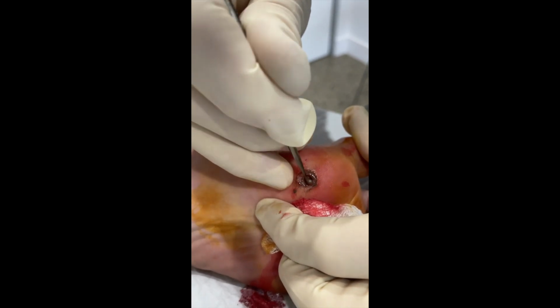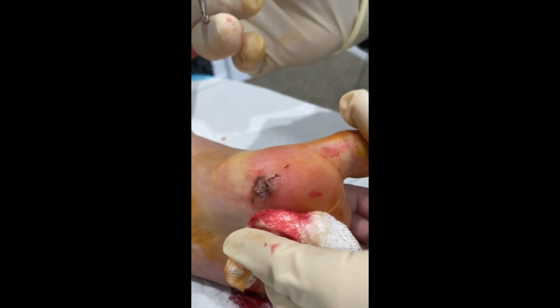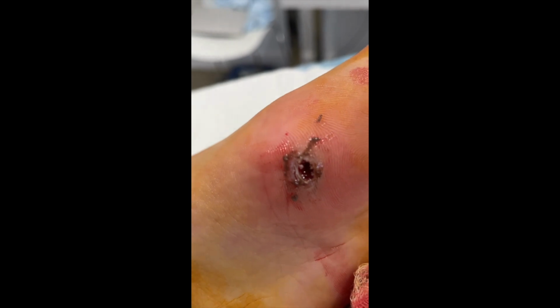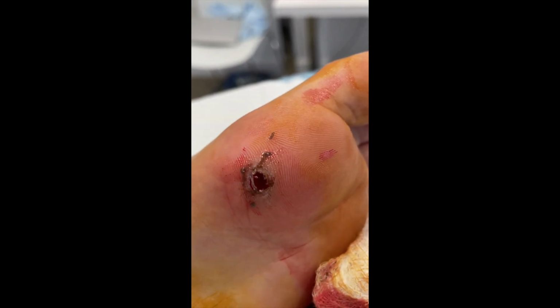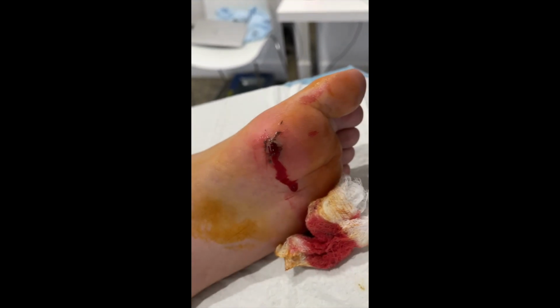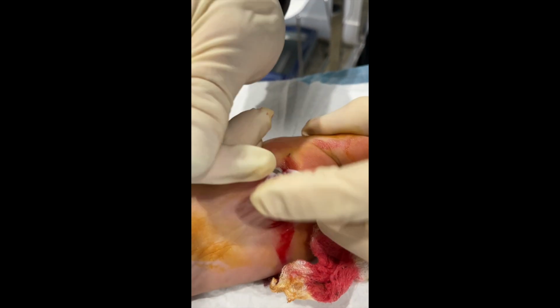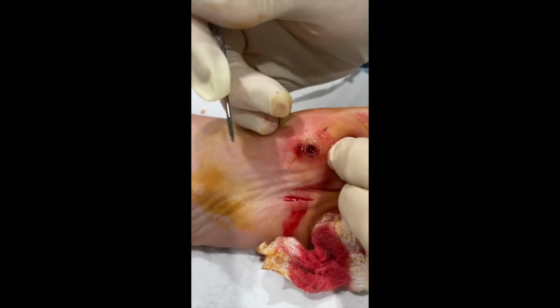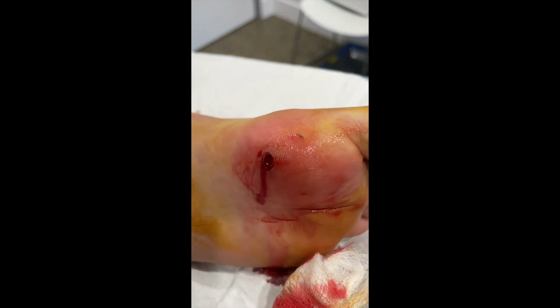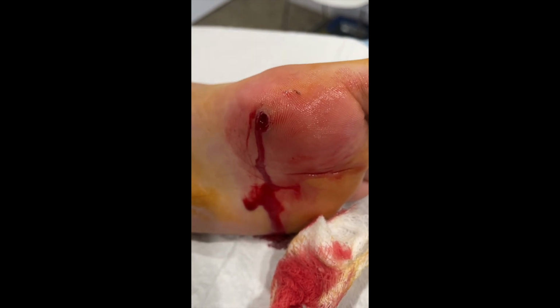Using the phenol, we apply it for around about 30 to 45 seconds, and this can be either done once or twice. In this situation, I've just done it once. Once I finish with the phenol, I then clean out the area that's been removed, and it also neutralizes the phenol, so we're using an alcohol wipe to go in and just clean the rest of it up.